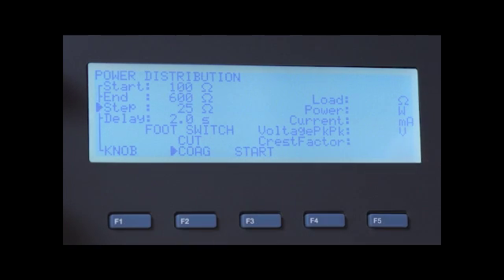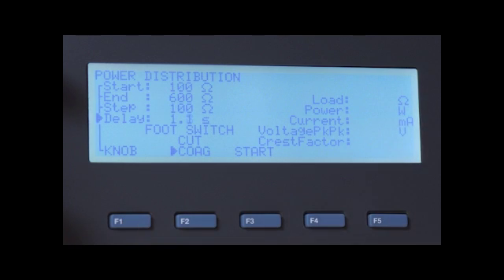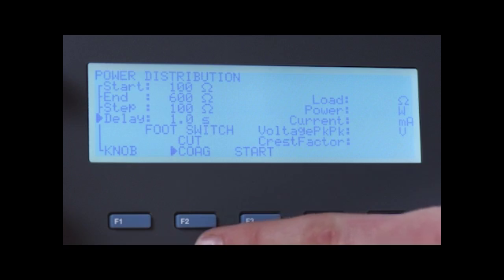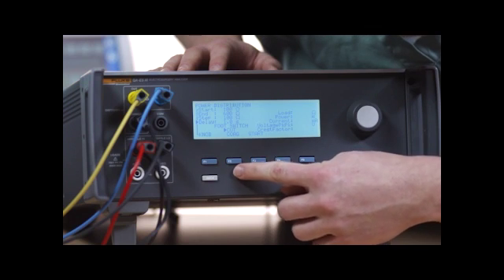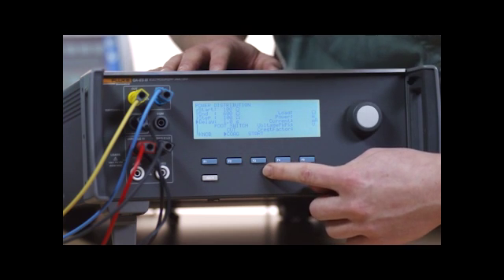Select cut or coag for the footswitch. Push F3 to start the measurement.